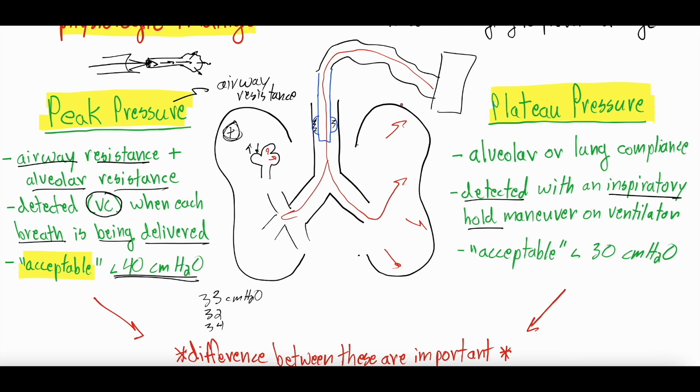Because your lungs are inflated, and your lungs are tissue. So as the air is pushing those lungs out, the lungs are also pushing back in. They're trying to deflate back down. And if you're not letting any of that air escape, the plateau pressure is the pressure that the vent is feeling as those lungs try to deflate when we won't let them. It's an inspiratory hold. So as one might assume then, that plateau pressure is more representative of the lung compliance.